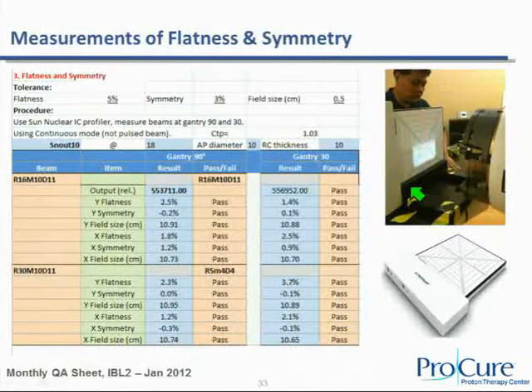Talking about two-dimensional arrays right now. Again, there is nothing except for the Zebra, really. There are no dedicated proton therapy QA devices, really. You just have to go with what's available in the market and adapt it to your own needs.